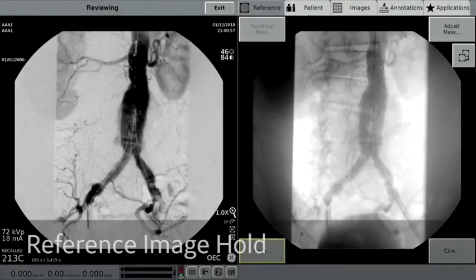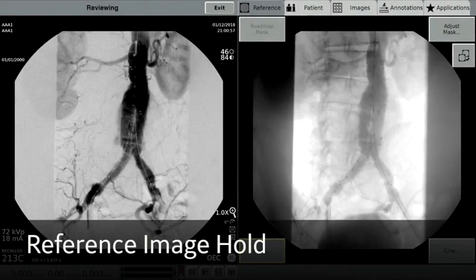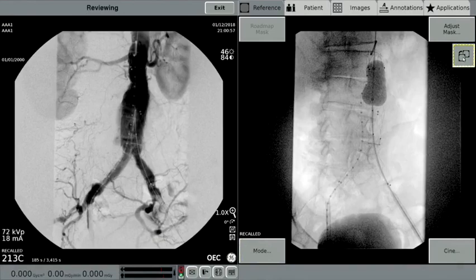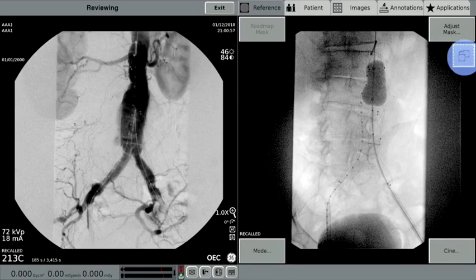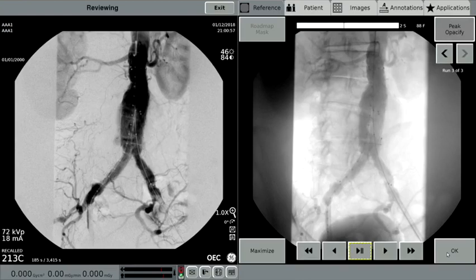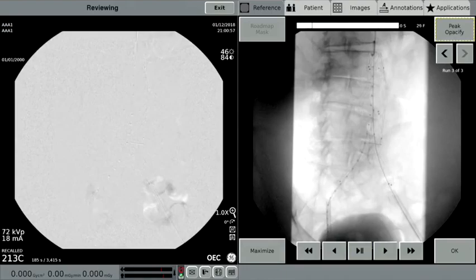This demonstration is of the Reference Image Hold feature available on the OEC Elite CFD. Reference Image Hold brings additional flexibility for viewing and comparing same-patient images during a clinical procedure. In this example, a subtraction run is displayed on the left screen. A Reference Image Hold icon is available on the right screen, allowing a user to switch or toggle between two images on the right screen for prior image to live image comparisons, such as a non-subtracted image or reference scout image. This feature brings choice and flexibility to easily view prior images for comparisons during surgery.